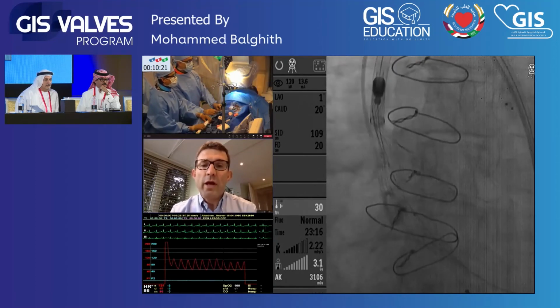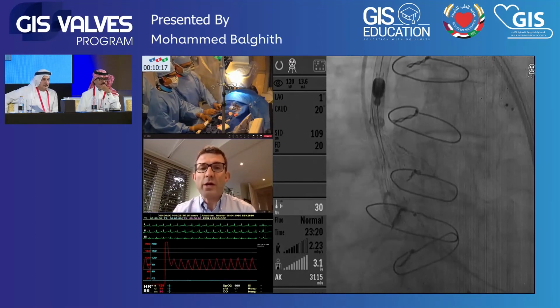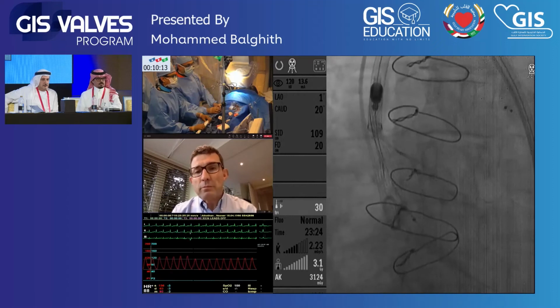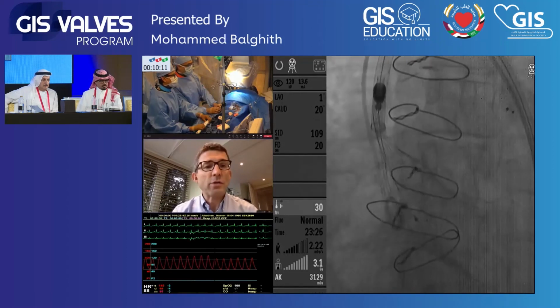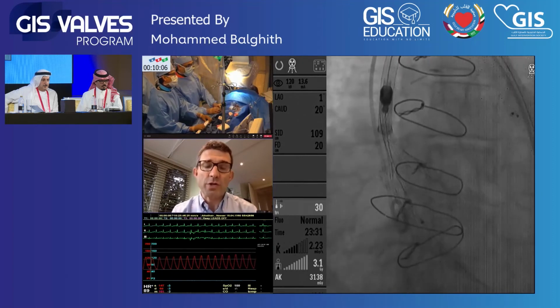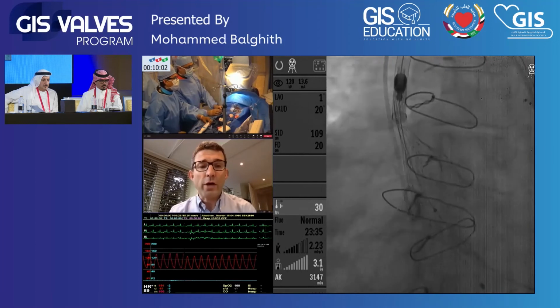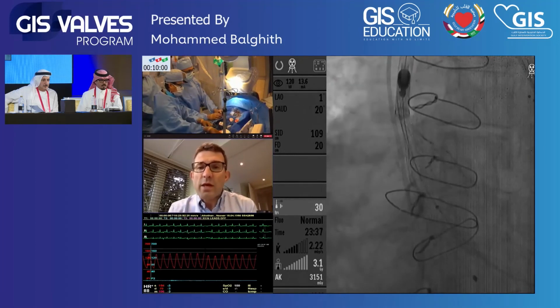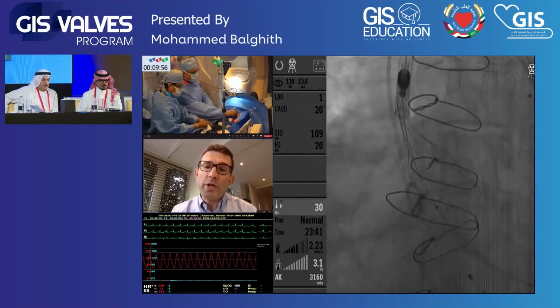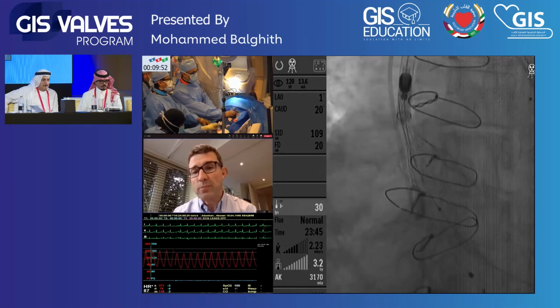We can take the picture now. This now allows for a safe post-dilatation should we need it. Okay, we will see. And I think that looks good. Your catheter is also central in the aorta, so it's not overlying the greater curvature or the lesser curvature. Excellent. So I think at this point you've got a nice stable catheter position, which means there shouldn't be a lot of tension stored within the catheter.